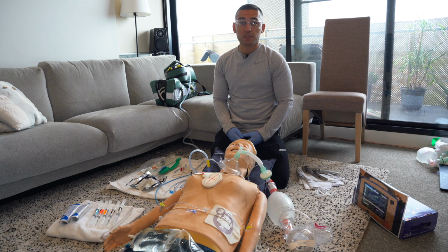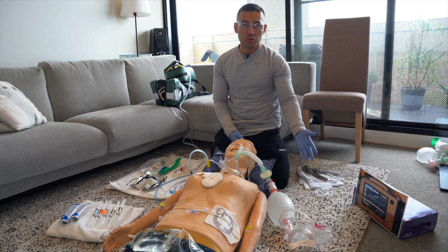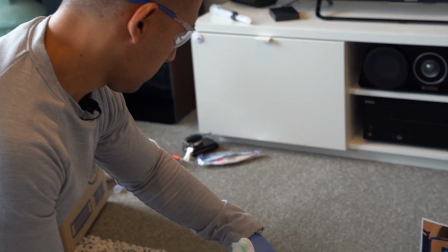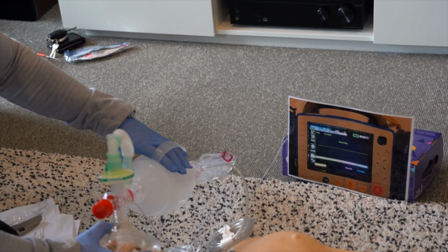Suction should also be tested with the suction catheter placed in an easily identifiable location, such as just under the patient's right shoulder. On the left side of the patient's torso is the monitor. It has been positioned here to allow all paramedics on scene to easily view it. Non-invasive blood pressure, ECG, SpO2 and end-tidal CO2 should be monitored continuously.